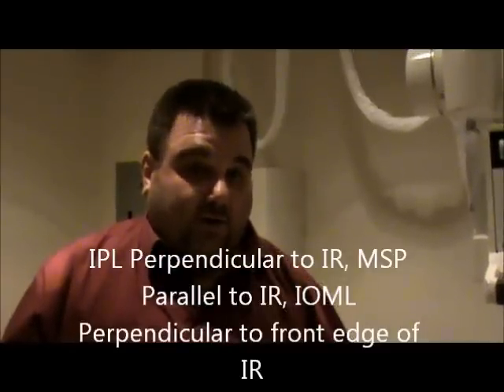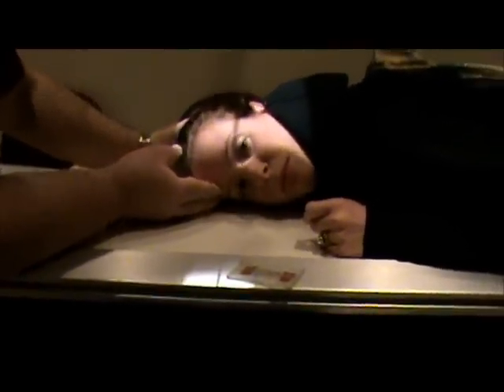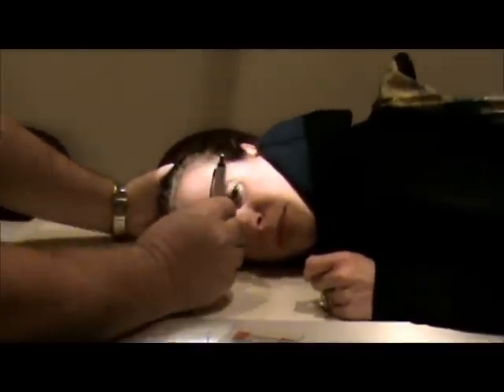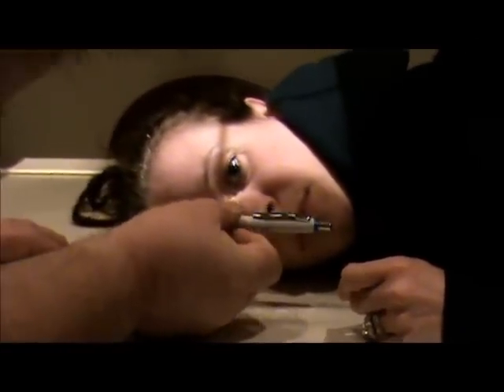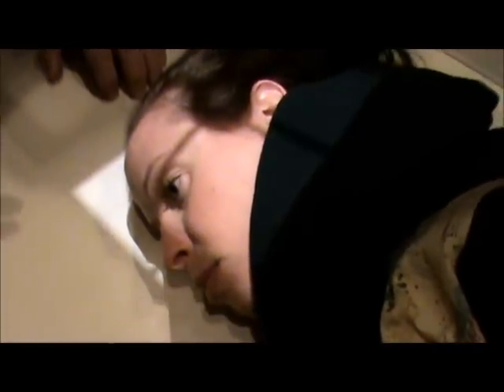There are three things to verify on a lateral. First, the IPL needs to be perpendicular to the IR. Second, the MSP should be parallel to the IR. Third, the IOML should be perpendicular to the front edge of the film or the table. I'm going to rotate her head so one eye is right over top of the other for the IPL. Then I check the MSP by looking at the middle of the chin, nose, and forehead. Then for the IOML, I tuck the chin toward her chest just slightly to get a true lateral position.